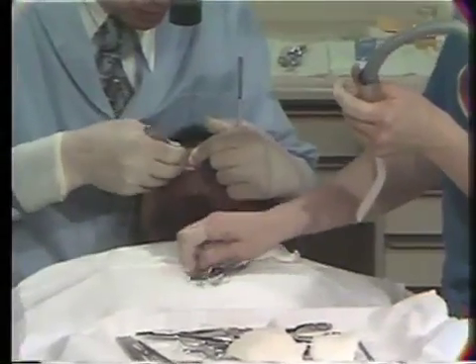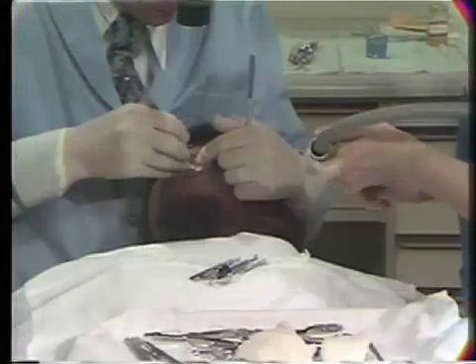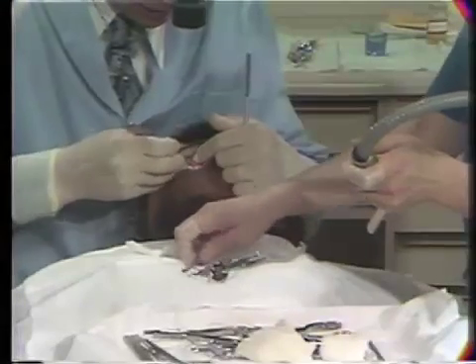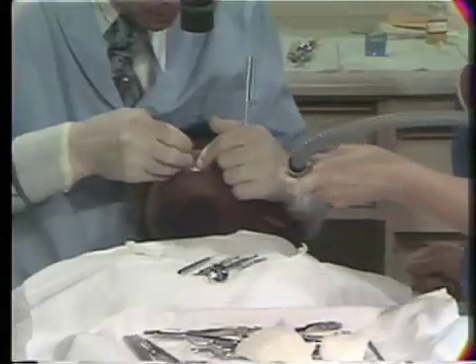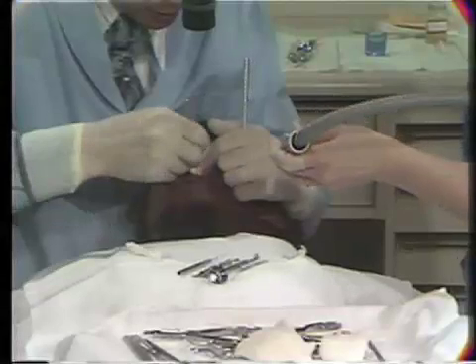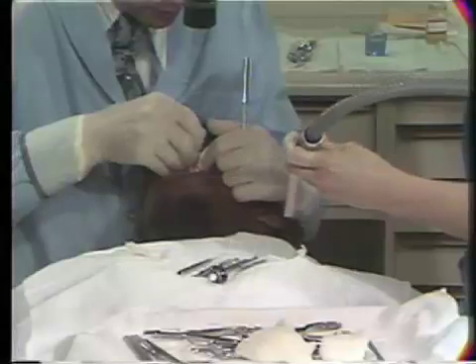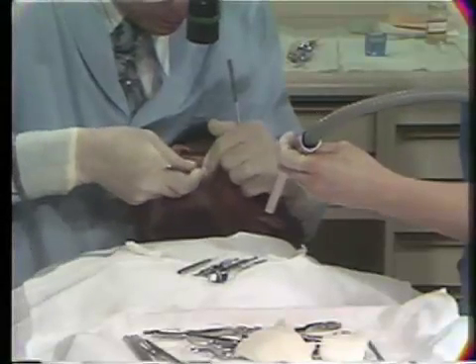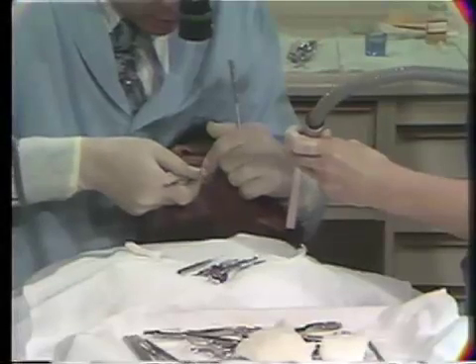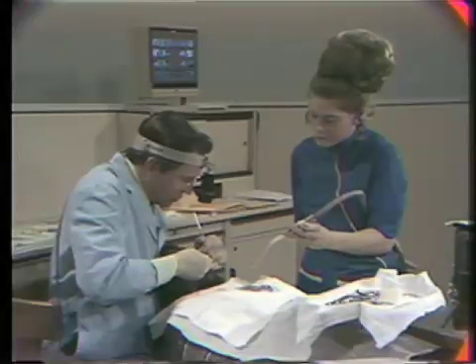While she's evacuating, she's also placing the instrument on the chest of the patient, where we use this area as a bracket table. So we have both a bracket table and, immediately underneath the patient's chin, an area for the placement of instruments, so they're readily available to either the assistant or the operator. And she stands and watches, and anytime she sees an area that needs evacuation, she moves in, or if I request it, in just one word and she's there.